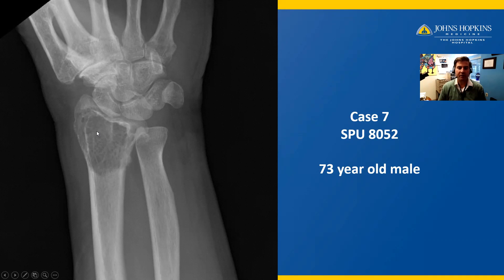There is no matrix formation. However, there are white lines corresponding to cystic changes. This patient is skeletally mature, as you can see — the nearby ulna growth plate has closed.